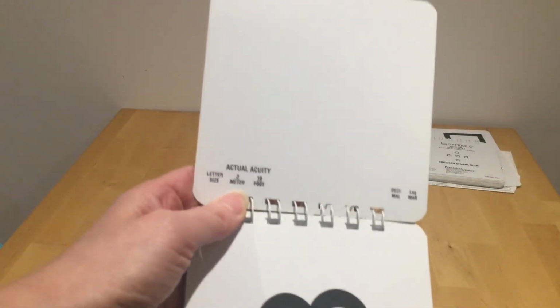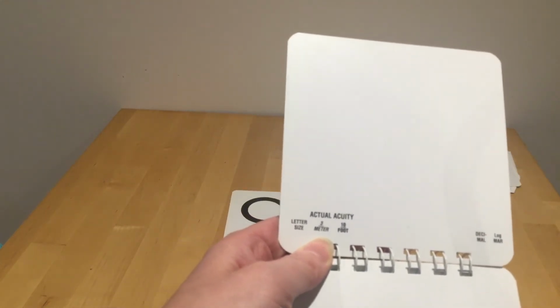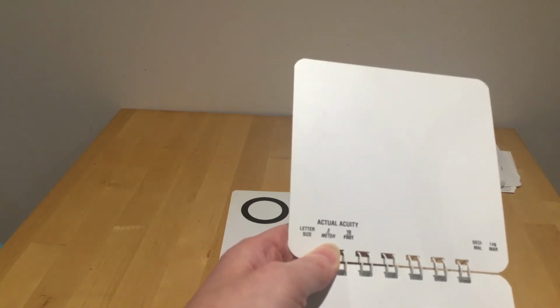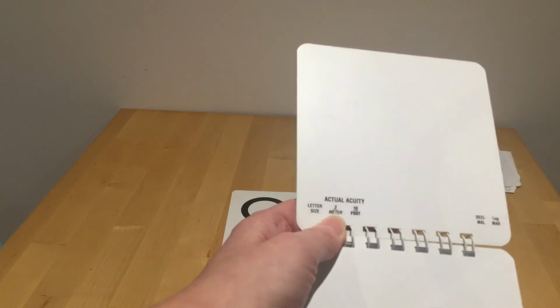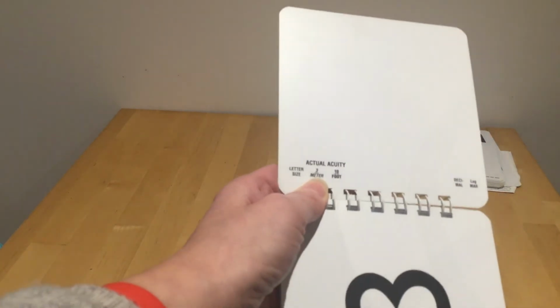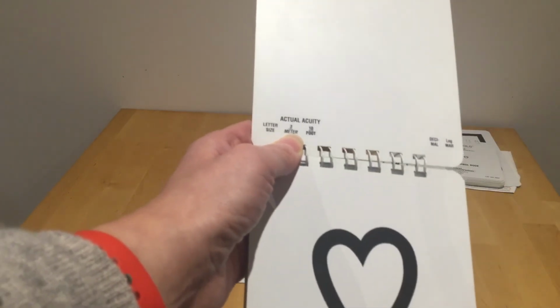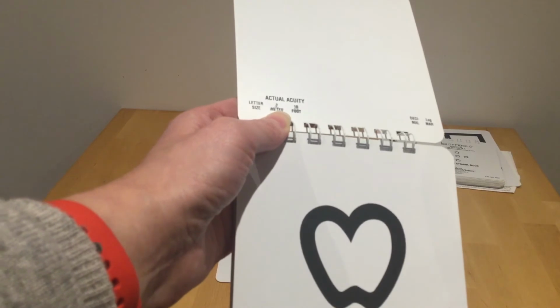Now if I flip open the first page, and if we look at the part just under my thumb, it gives acuity, and it tells you here that it's 3 meters. So that tells you immediately what distance you need to be from the child or young person to administer this assessment.